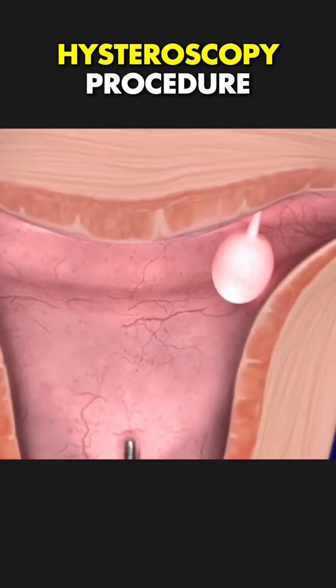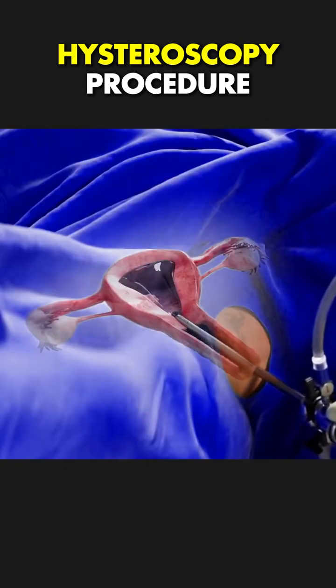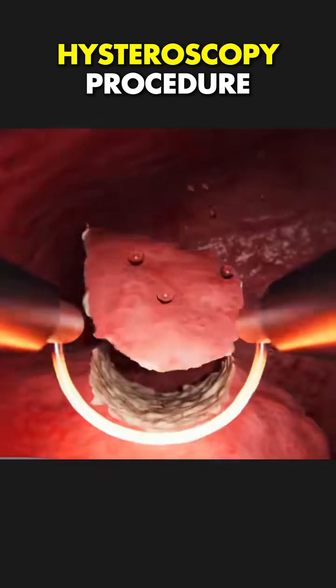Ever wondered how doctors remove uterine polyps and fibroids without major surgery? It's done through a procedure called hysteroscopy. Here's how it works.